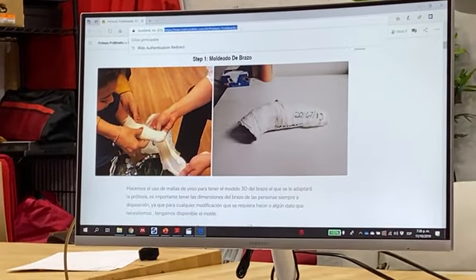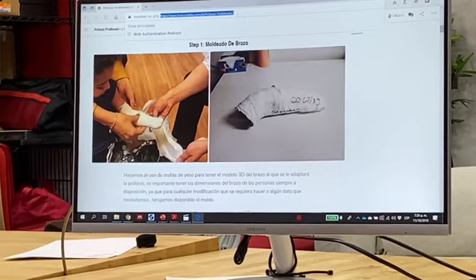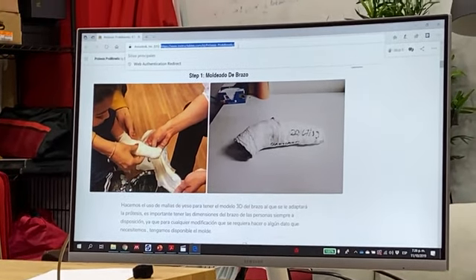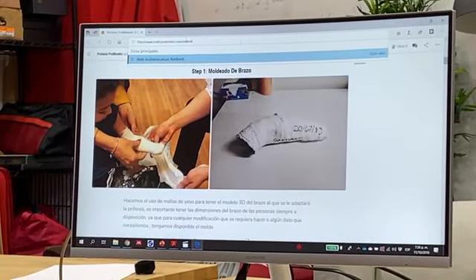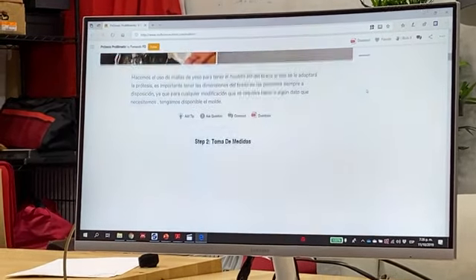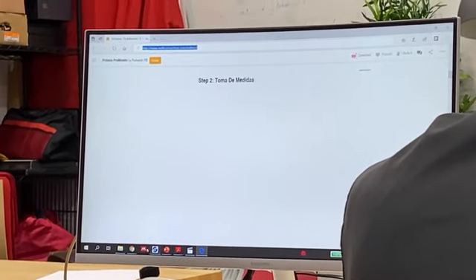Okay. So as not all people have a 3D scanner, we show the method using plaster. It is an example of how to take the plaster, right? Sorry, this is not working in this Explorer. And that process is the same thing we're proposing to do with a resin rather than plaster. So the fiberglass resin impregnated tape, which is activated by water, could make an exact fit, just like he's doing there with making that mold.